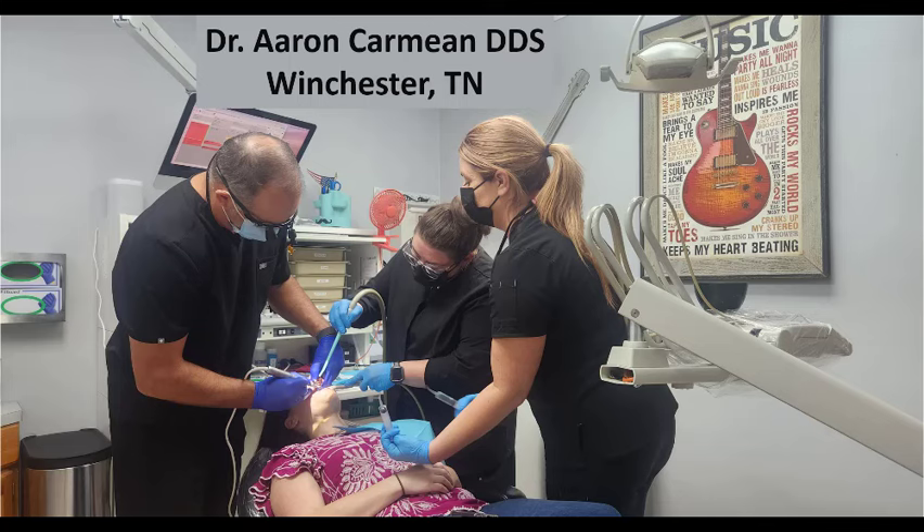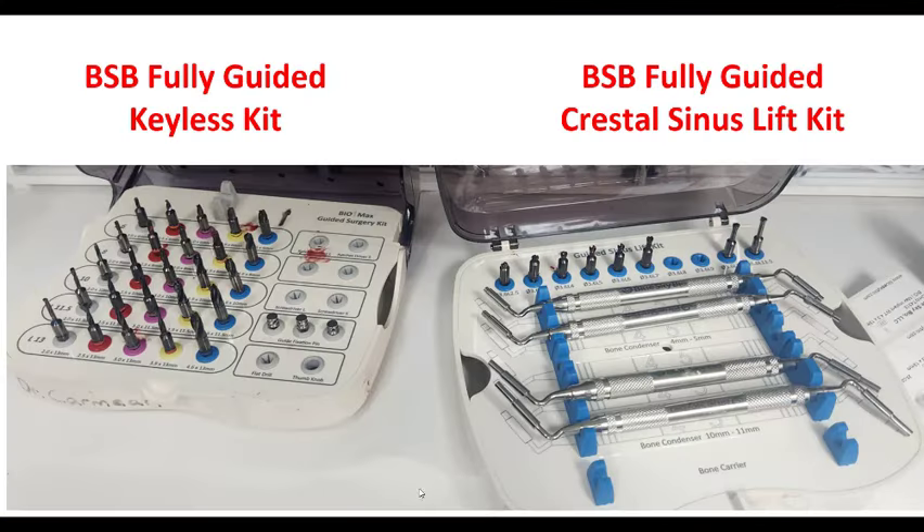I think it makes sinus lifting about as dummy proof as possible. Here's the stars of the show. This was a surgical picture, so there's a little blood and stuff on it, but we used the fully guided keyless kit for the majority of the arch. But on those individual sites, we used the fully guided sinus lift kit. That'll really be the star of the show on this particular video.